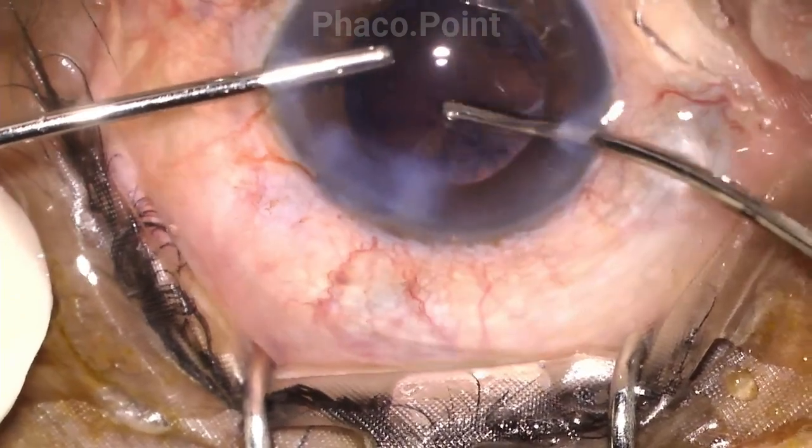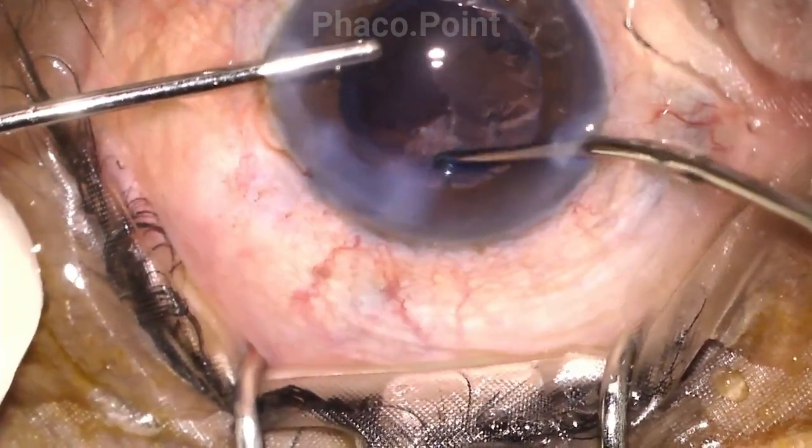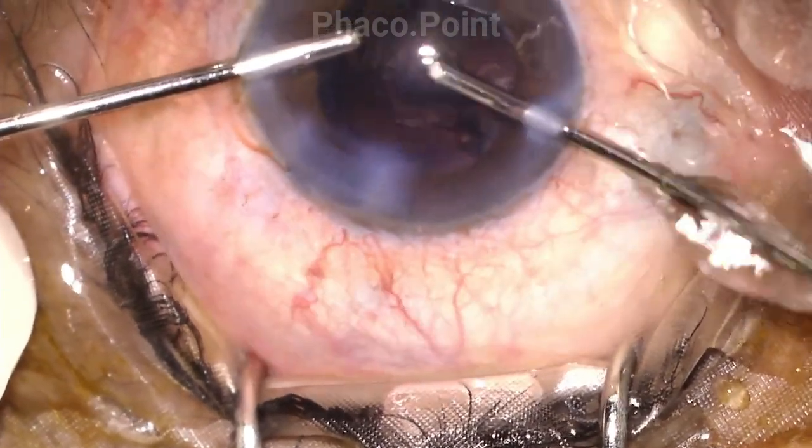The rest of this surgery depicts the irrigation aspiration, the introduction of the lens, the visco wash, and finally the stromal hydration.